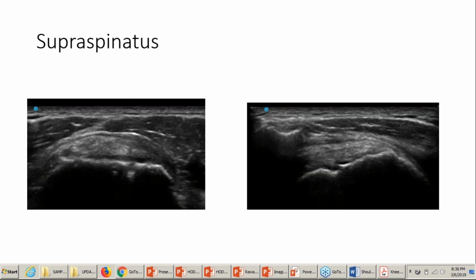So let's say this patient presents with some recent onset shoulder discomfort. Maybe there was a history where they were doing something in their garden and that triggered the pain, and now they present to you. Then I will look at the bursa and their long head of biceps tendon sheath and other things. If I see fluid there, then it's possible that they re-injured, and maybe the partial tear. So they had, out of 120 fascicles, some torn before, but now they tore another 10 or 20 more after that injury.